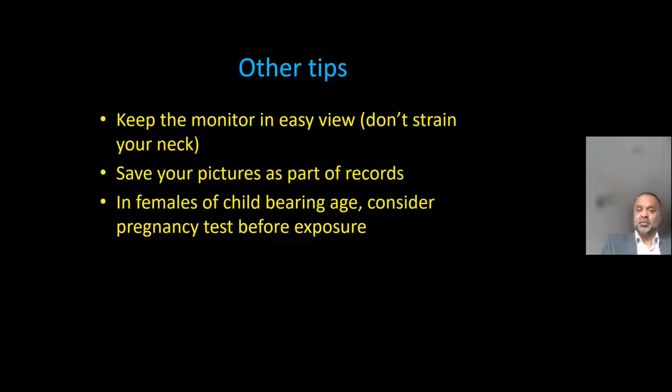I also save pictures as part of patient records. Not all pictures. So if I'm doing, let's say, facet joint denervation, then I would make sure that I have saved the final picture before I create a lesion or do the burn. That, in addition to my sensory and motor thresholds, also tells me that the procedure should be effective and it should be safe.